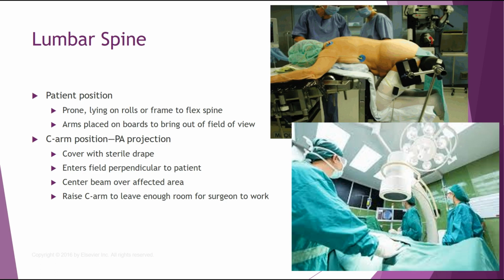Okay, and I know this from personal experience. That is the surgery that I had. So I did not have them do a posterior fusion. Instead, it was an anterior approach. And it was fabulous. Had no problems with that. But normally, they are going to be prone.